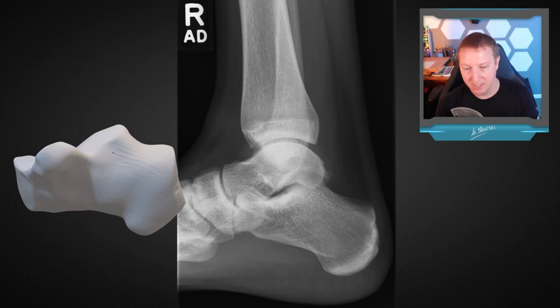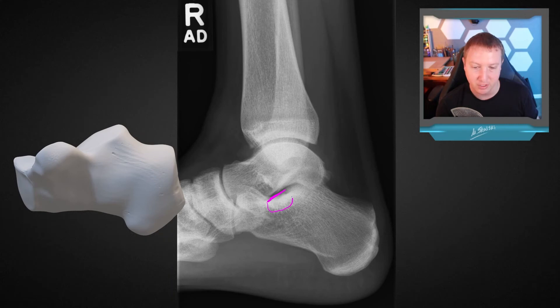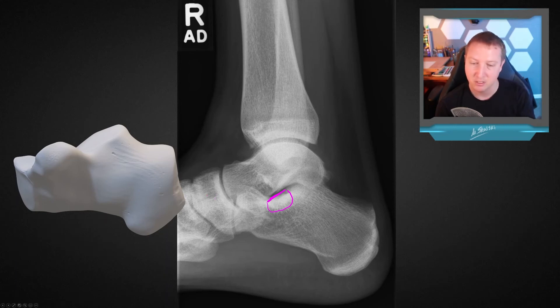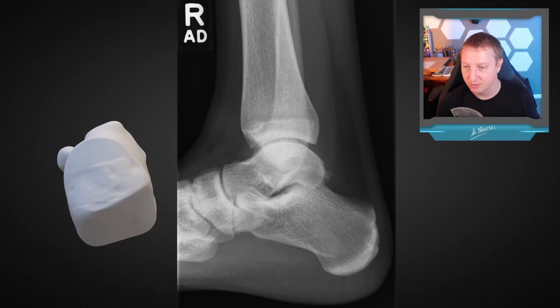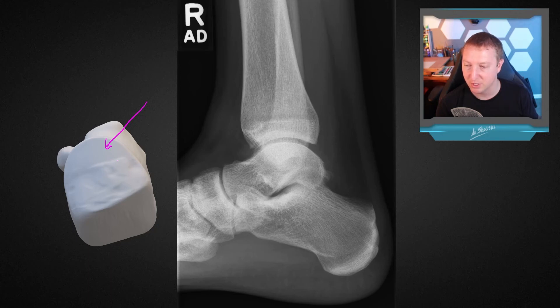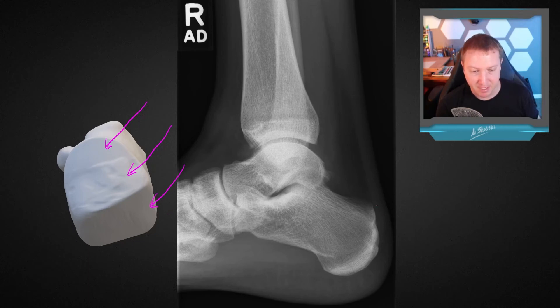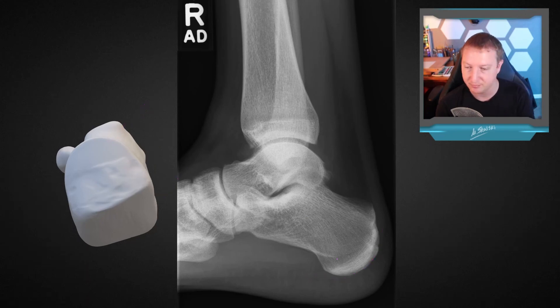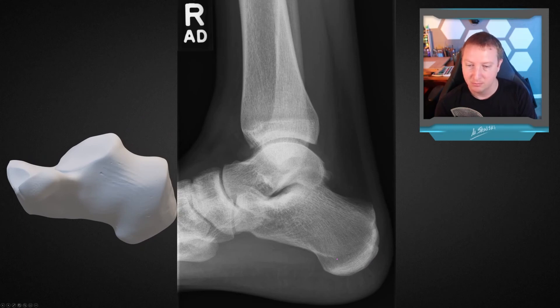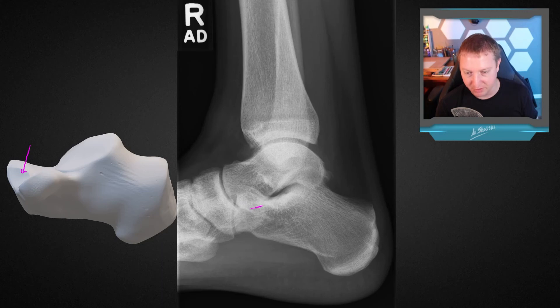Let's talk more about the calcaneus. The sustentaculum tali is not outlined that well on this image because the view is a bit oblique — we see the edge of the articular surface but often the full cortical margin shows in this region. On a better lateral, we can see the posterior surface of the calcaneal tuberosity nicely: the smooth portion where our retrocalcaneal bursa lives, the Achilles attachment site, and the weight-bearing portion. There's actually fibrous continuity from the Achilles around into the plantar fascia. We also don't see the anterior facet of the subtalar joint well on this particular image.